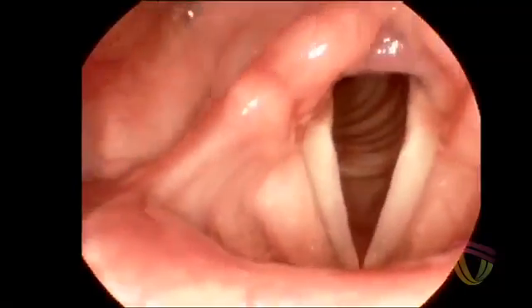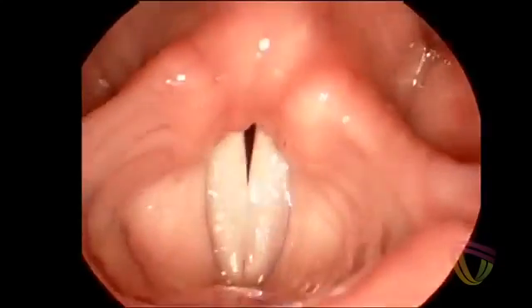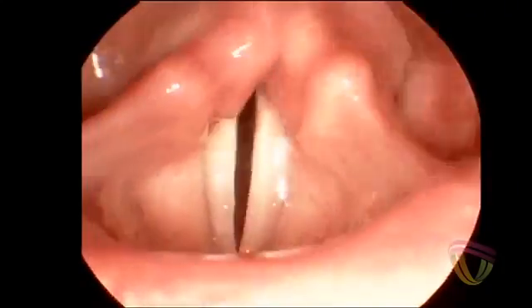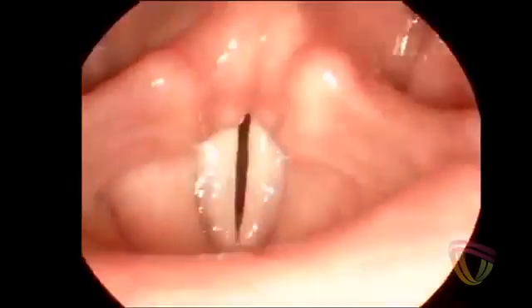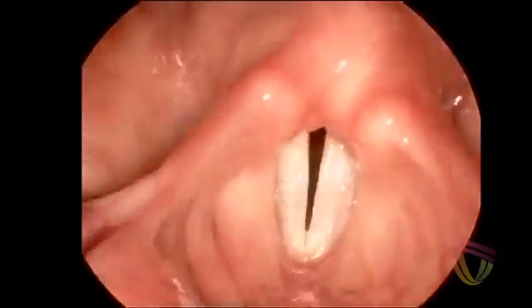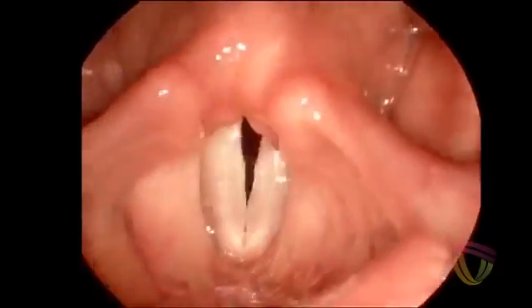Well, I particularly like this video because you can see that my vocal folds are sitting on top of my airway, and you can see my tracheal rings. And the first thing you see me doing is closing my vocal folds to make sound. And when the vocal folds close and air goes through them, you can see that they vibrate. I will run out of air and you can see that I open them up again. And then I go to make a sound at a slightly lower pitch, and then you can see my vocal folds are slightly shorter because the pitch is lower.